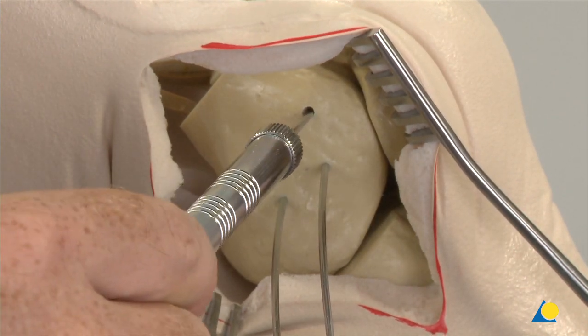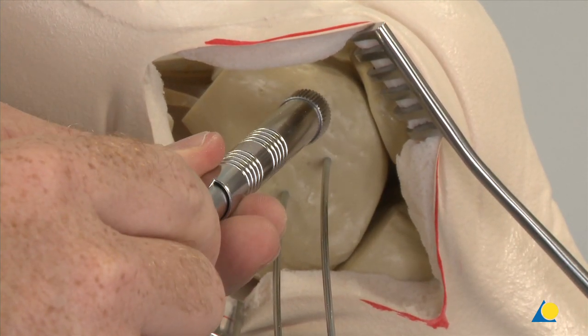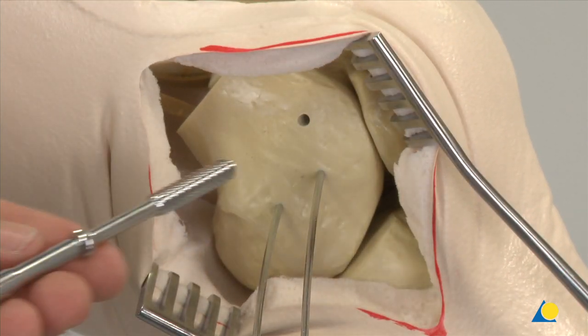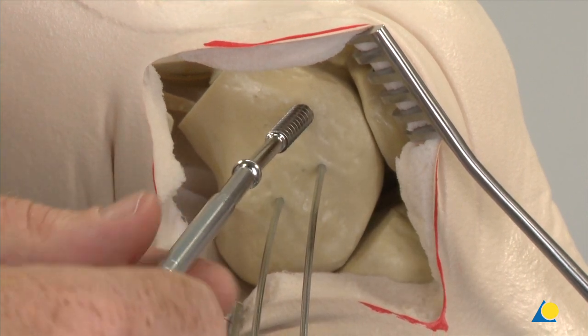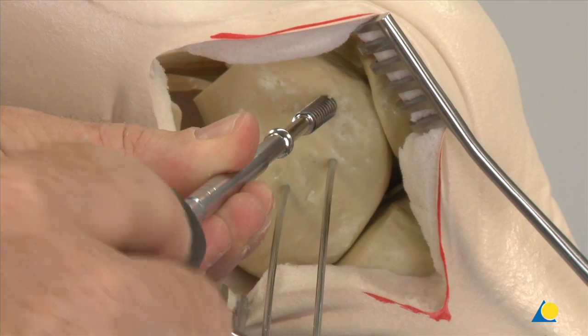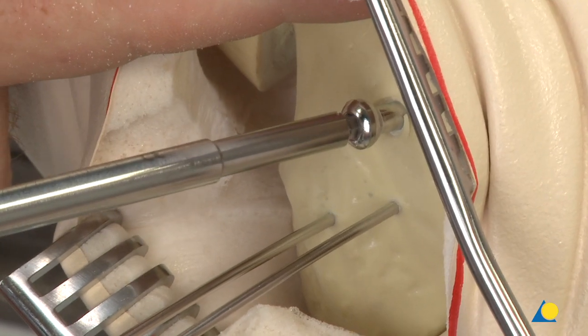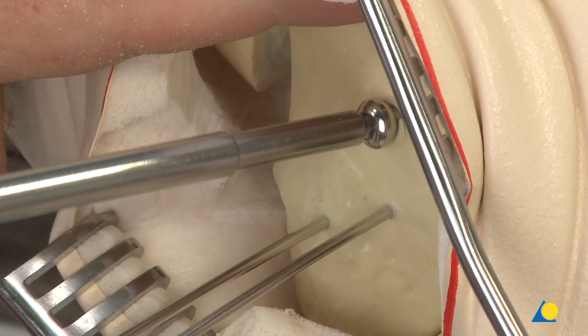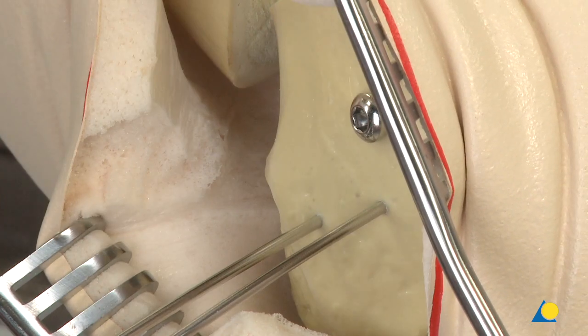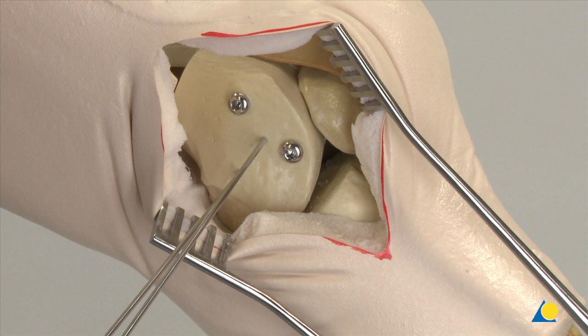The depth gauge is used to measure the screw length. The appropriate length 6.5 mm cancellous bone screw is inserted. For older patients with bad quality bone, a washer can be added. A second 6.5 mm cancellous bone screw is inserted in the same manner to ensure rotational stability.